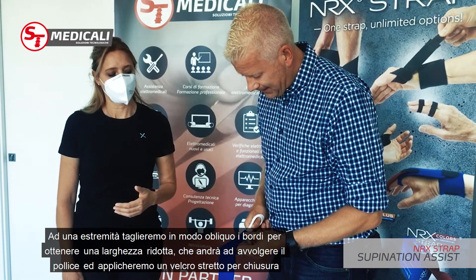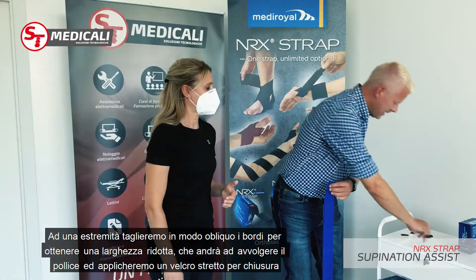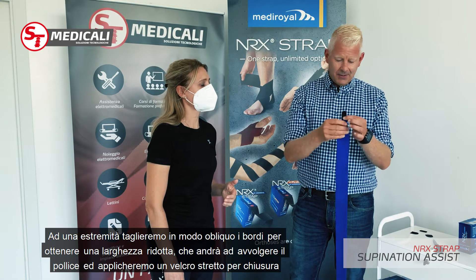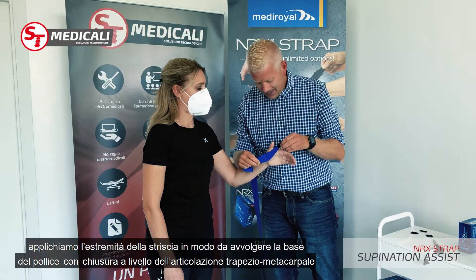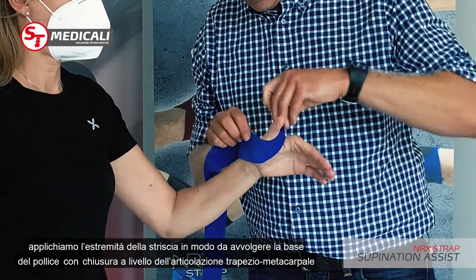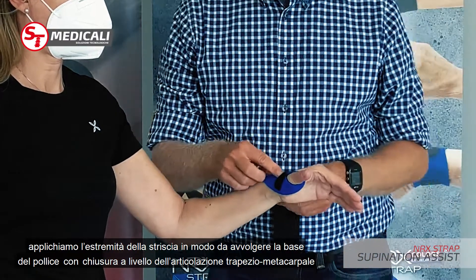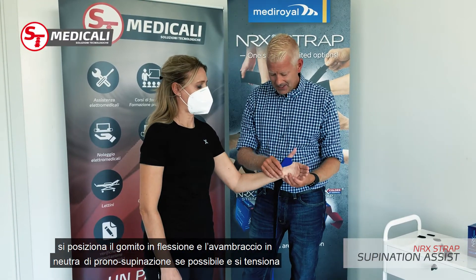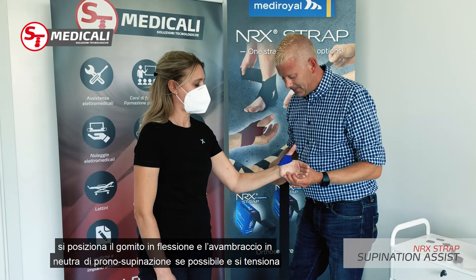Once I've cut it at an angle like this — you can see it's narrower up here — on that side I take one of the narrower hooks and apply that. I then go around the thumb like this, creating a small sling using the base of the CMC joint.